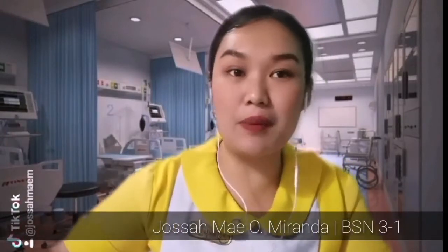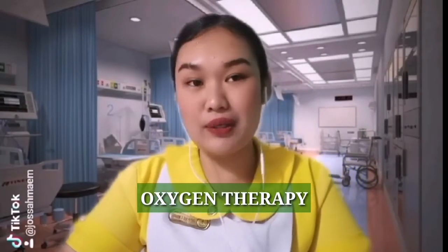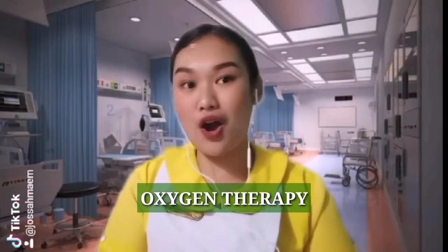So for today's video, I'm going to discuss and teach you how to perform oxygen therapy, also known as O2 therapy. O2 stands for oxygen gas. So first things first, what is oxygen therapy? Oxygen therapy is a treatment that delivers oxygen gas for you to breathe. You can receive oxygen treatment from a tube resting in your nose, a simple face mask, or a tube placed in your trachea or windpipe. This treatment increases the amount of oxygen to your lungs, received and delivered to your blood.